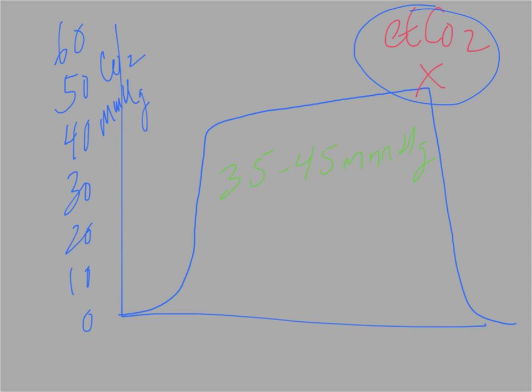Or is there really something going on with one of those three things we just mentioned, ventilation, perfusion, or metabolism? We'll get into great depths later on about that regarding each one of those three. But nevertheless, it could be any one of those three or any combination of those three. So you could have a ventilation or perfusion issue, or you could have a ventilation, perfusion, metabolism issue that is skewing what your numbers may be.